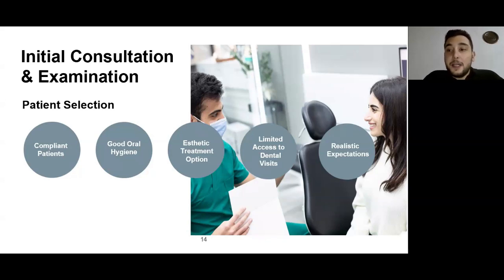Now, clear aligner therapy is going to be good for patients who are inclined towards aesthetic treatment options, obviously with it being a discreet alternative to fixed metal braces. And with the trend going towards aesthetic dentistry, this is going to be a good selling point for clear aligners to a lot of your patients.